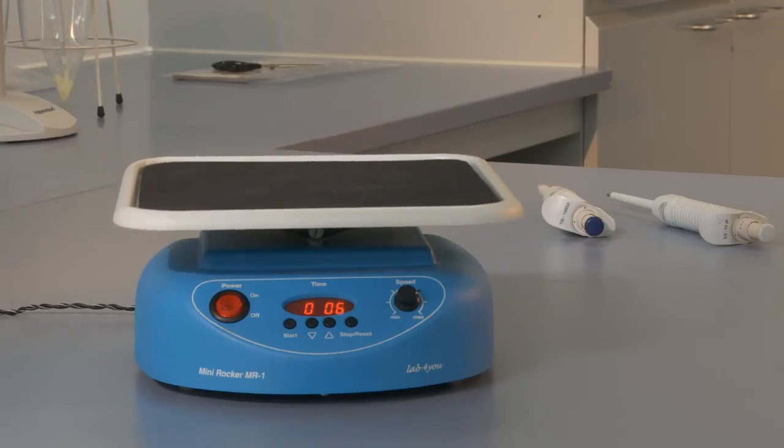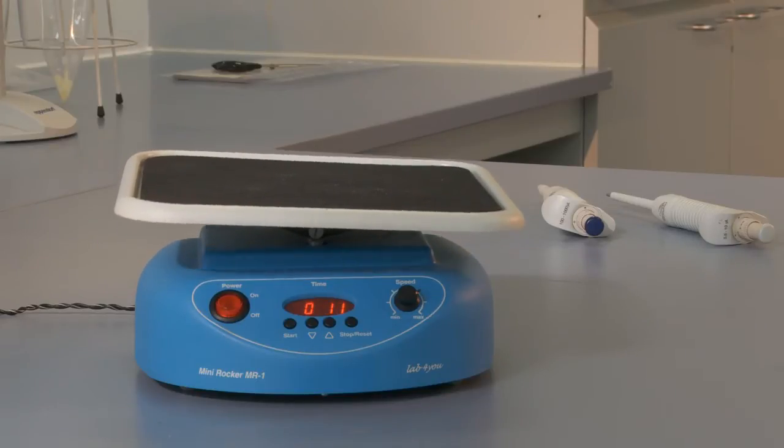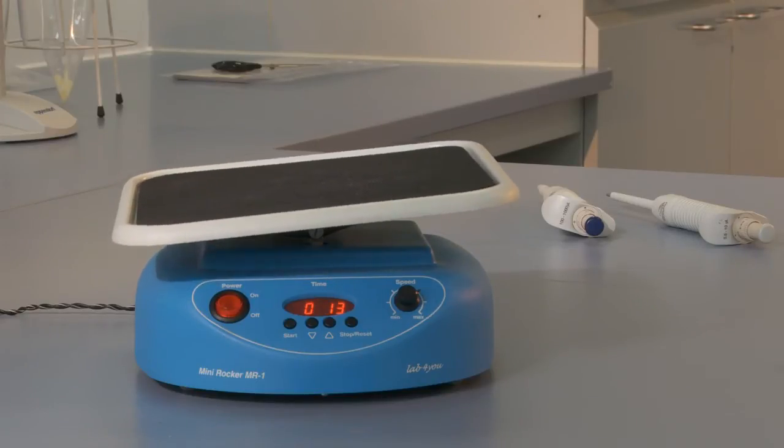Absolutely essential is a rocking platform capable of regular rocking motions to ensure optimal wetting of the blot strips during incubation.